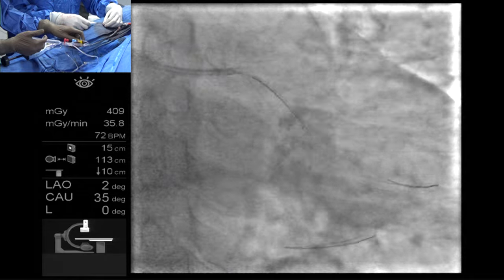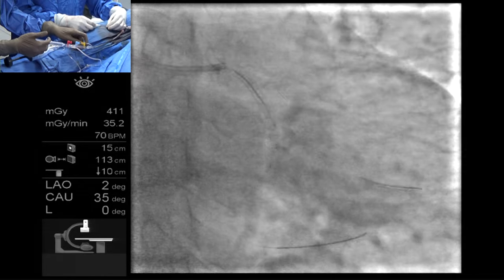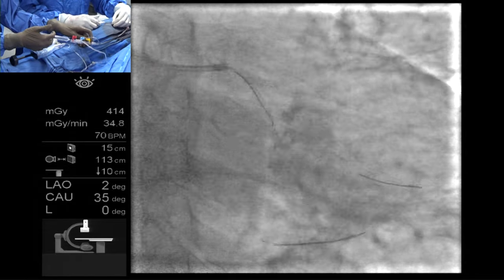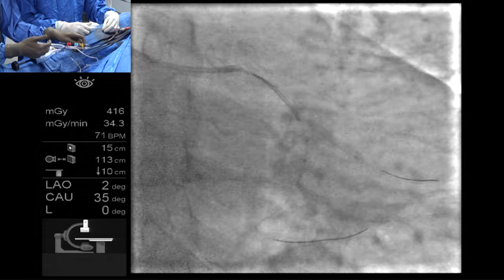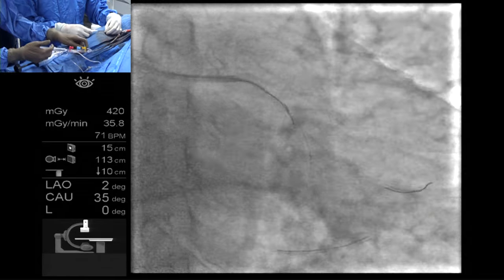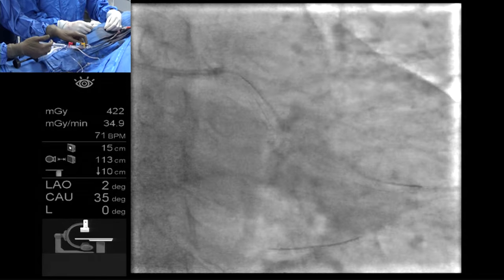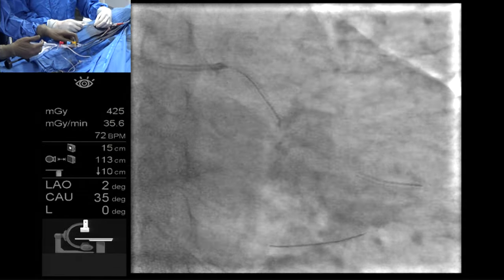So distal edge of the stent is okay, then would you like to keep the wire while crushing the stent? Yes, I like that. Leave the first wire in, right? Yes. I leave my wire in just because this is my landmark, so I can see where I'm crossing. It's definitely helpful to leave the wire in. Even with change, it keeps the geometry like it is.